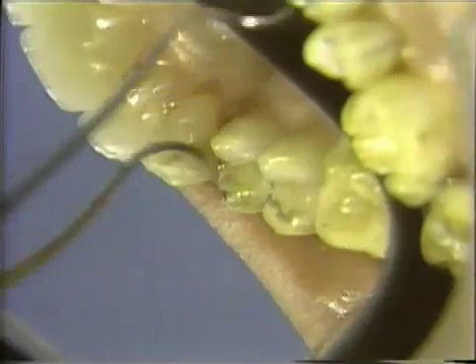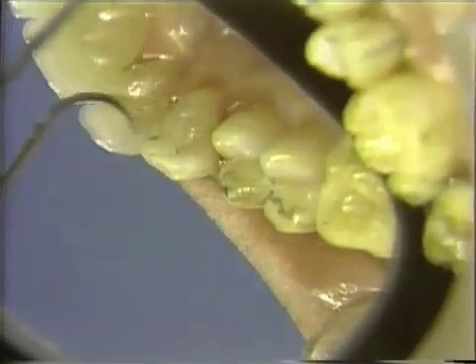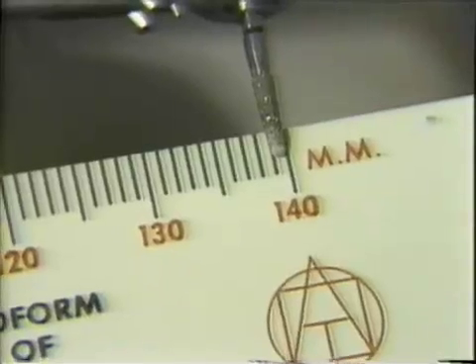Also on the cuspid, we have enough reduction on that surface going over the lingual. A half millimeter tracer cut will be developed using half the diameter of this diamond.